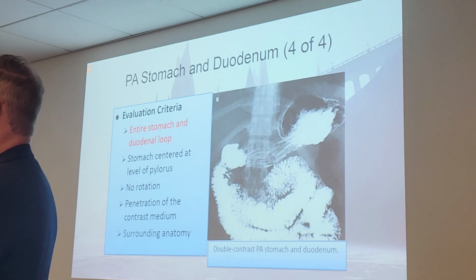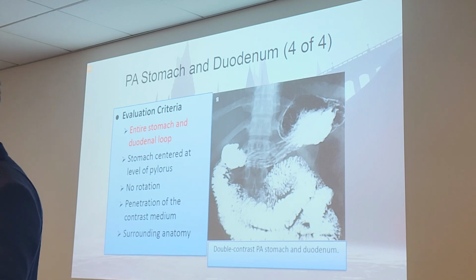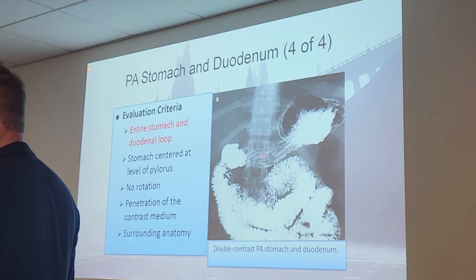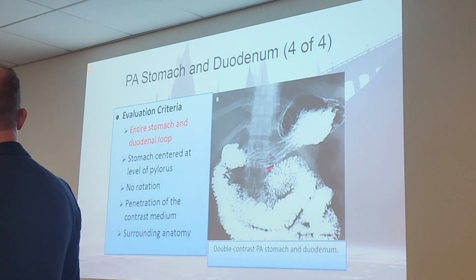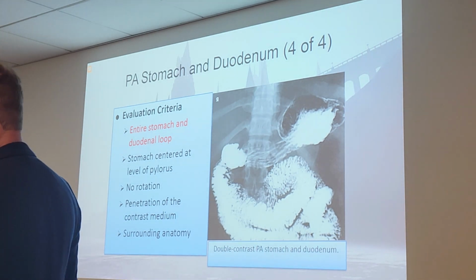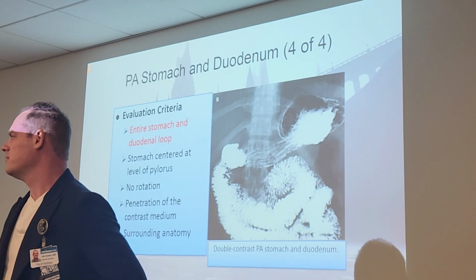Okay, so what do we want to see? What's the study show, guys? Entire stomach, keyword entire stomach, and duodenal loop. Like I said, as a student, this was a nightmare to get all this on a single radiograph. It would give me so much anxiety doing these films. Because even the book cut off a part of the stomach there. That would be an auto fail, according to my teachers. So how would you do it?